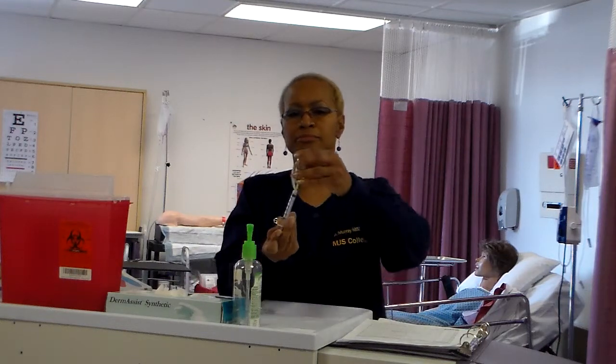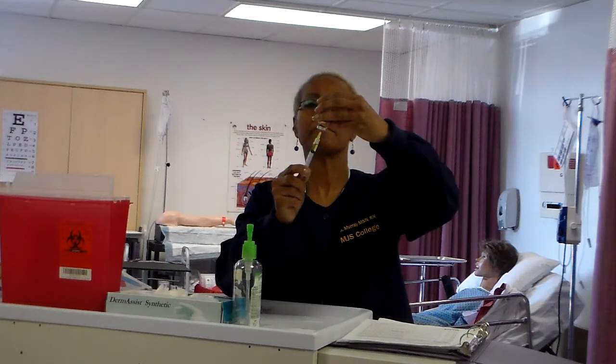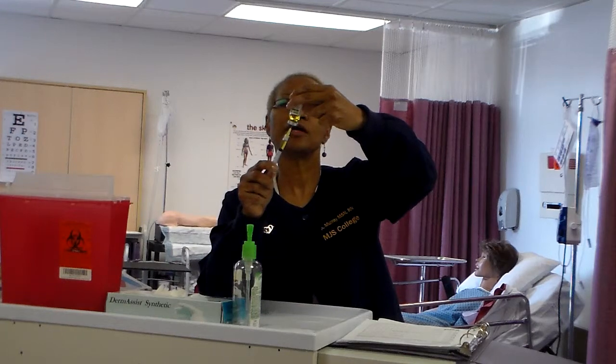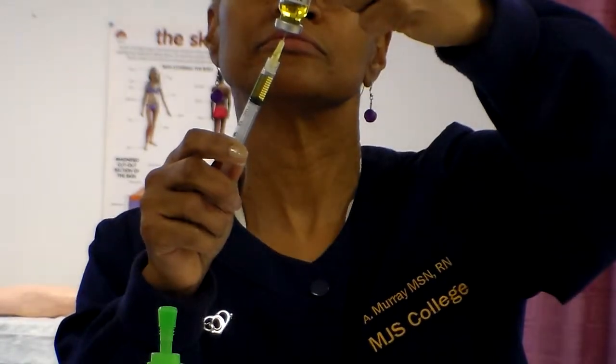Invert vial while keeping firm hold on syringe and plunger. Hold vial between thumb and middle fingers of non-dominant hand. Grasp end of syringe barrel and plunger with thumb and forefinger of dominant hand to counteract pressure in vial. Okay. Keep tip of needle below fluid level. I don't know if you can see that. There you go. You're below the fluid level when you're withdrawing. Allow air pressure from the vial to fill syringe gradually with medication. If necessary, pull back slightly on plunger to obtain correct amount of solution.